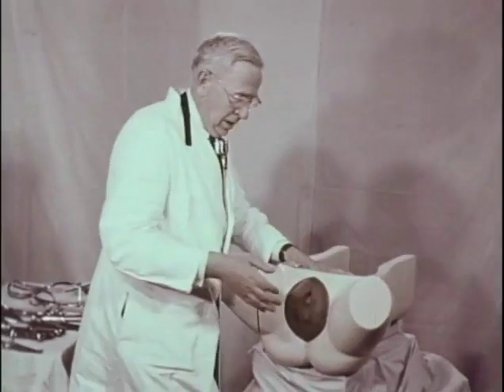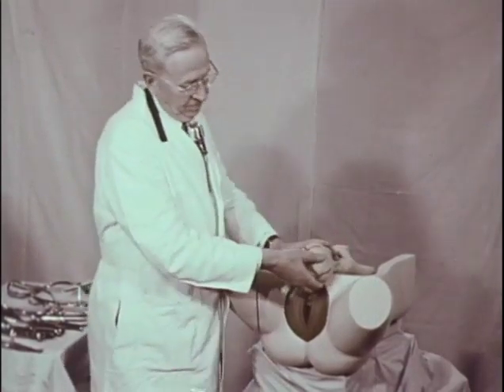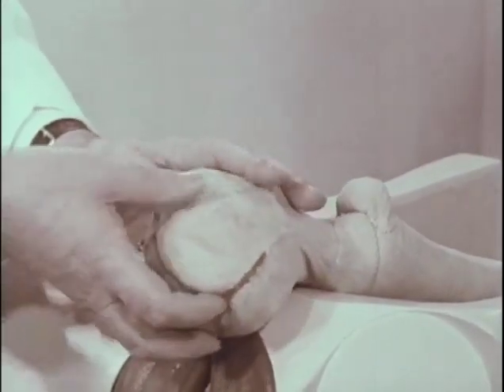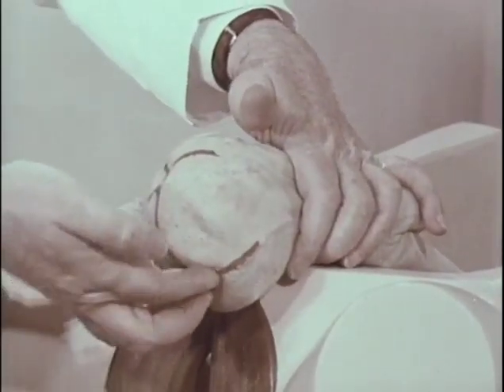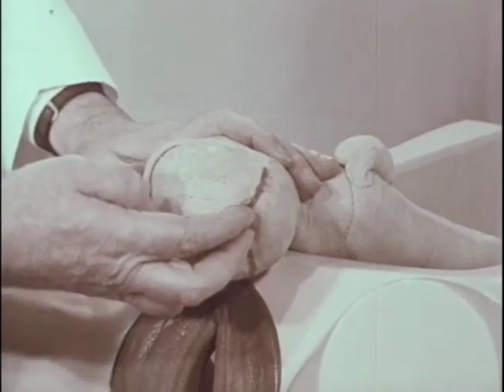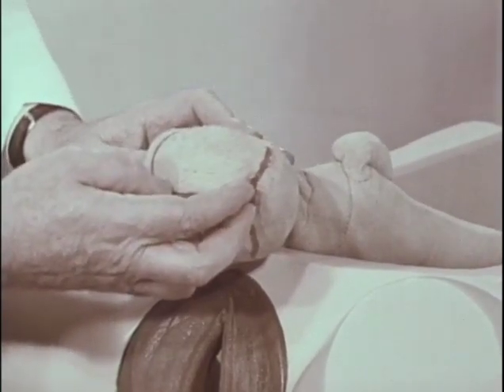The next maneuver, the combined manual and instrumental rotation of an occiput posterior to anterior. Here, either by the digital or the manual maneuver, preferably the digital, although it may not be successful in more than 25 or 30% of the time, it avoids that possible hazard of displacement. The head is rotated digitally to an LOT. Resistance to further rotation influences the operator to apply the forceps to a transverse by the wandering maneuver, as has already been described.